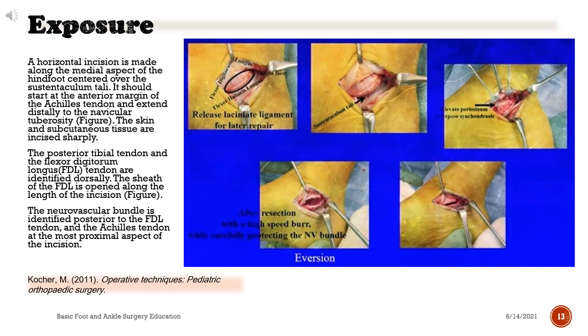A horizontal incision is made along the medial aspect of the hindfoot centered over the sustentaculum tali. It should start at the anterior margin of the Achilles tendon and extend distally to the navicular tuberosity. The skin and subcutaneous tissue are incised sharply. The posterior tibial tendon and the flexor digitorum longus (FDL) tendon are identified dorsally. The sheath of the FDL is opened along the length of the incision. The neurovascular bundle is identified posterior to the FDL tendon and the Achilles tendon at the most proximal aspect of the incision.